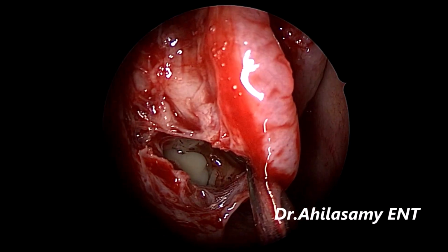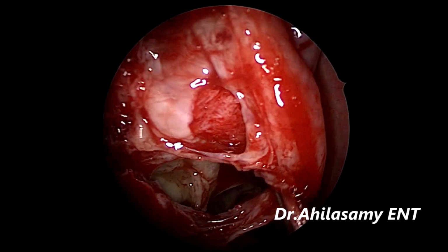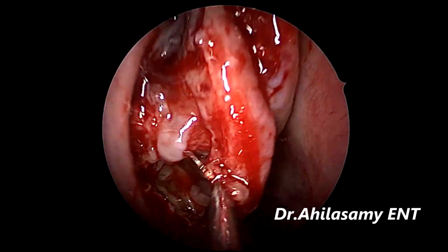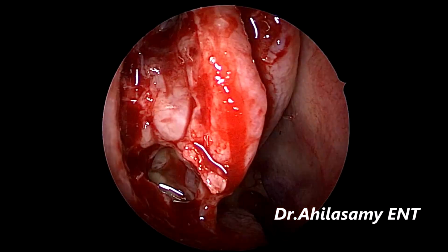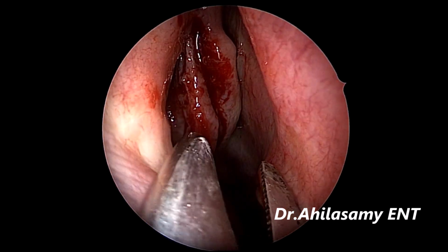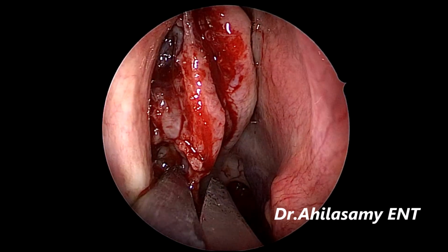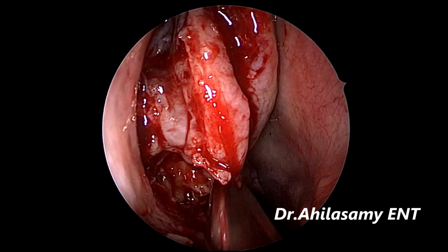In one stroke, you go into the antrum. You can see the pus collected inside the maxillary antrum. Then don't pull the uncinate. You just resect the uncinate at the superior part and inferior part and take it out. Just sucking the pus out.